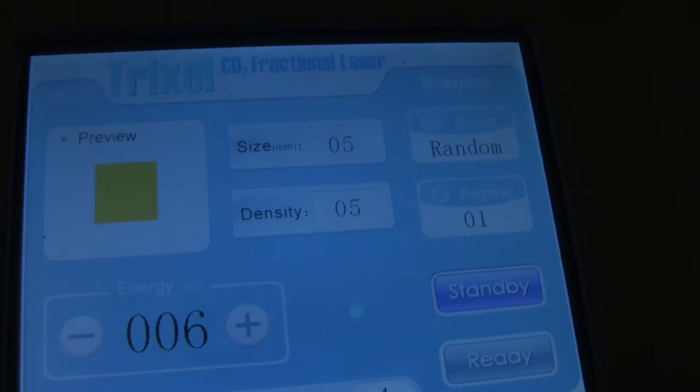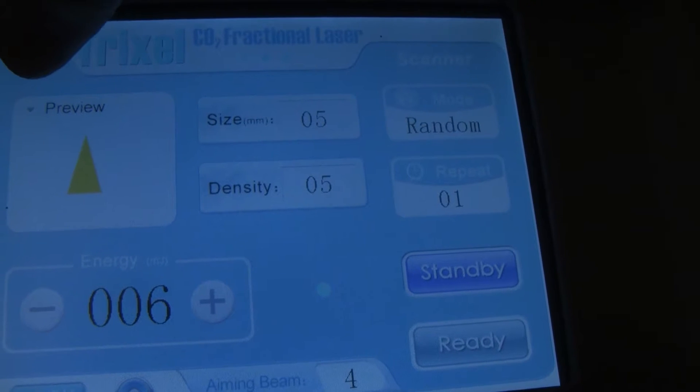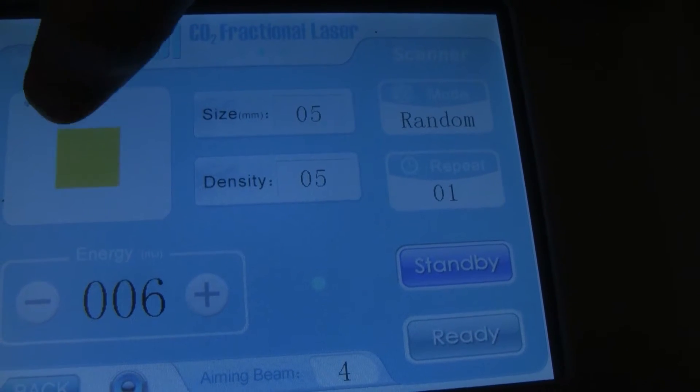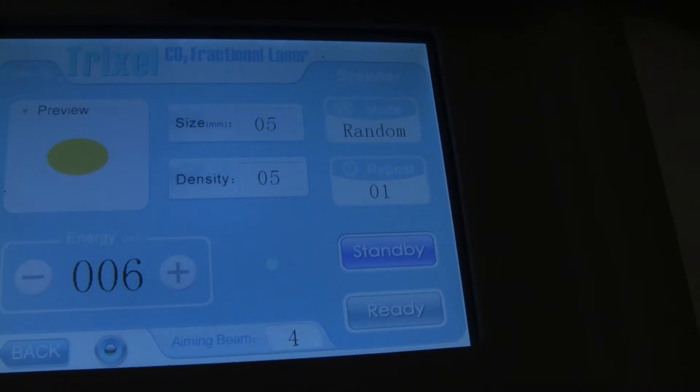In the scanning mode there are several different patterns you can choose from. There's the square, rectangle, triangle, circle, oval — so it's all of those. We'll go ahead and just put it on the oval for now.